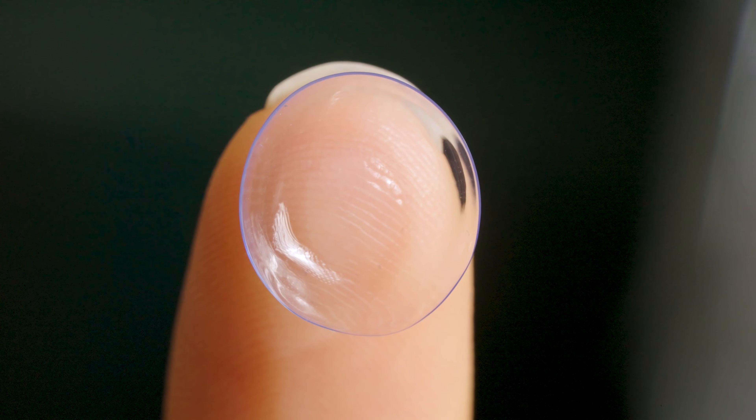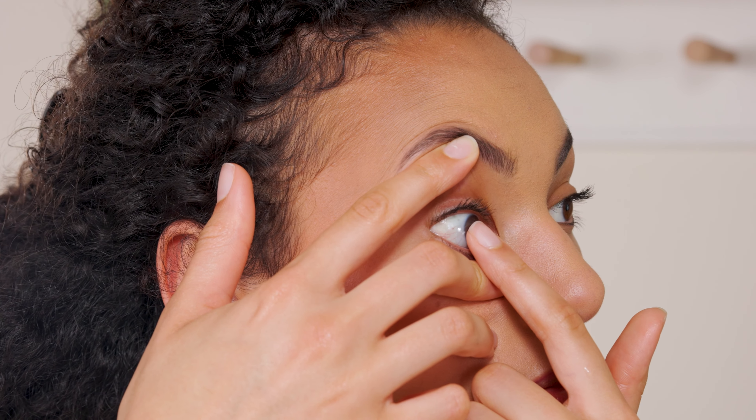Now your lens is clean and the right way round, you're ready to pop it in. We're going to show you three methods for applying your lenses, so you can choose the way that feels most right for you.